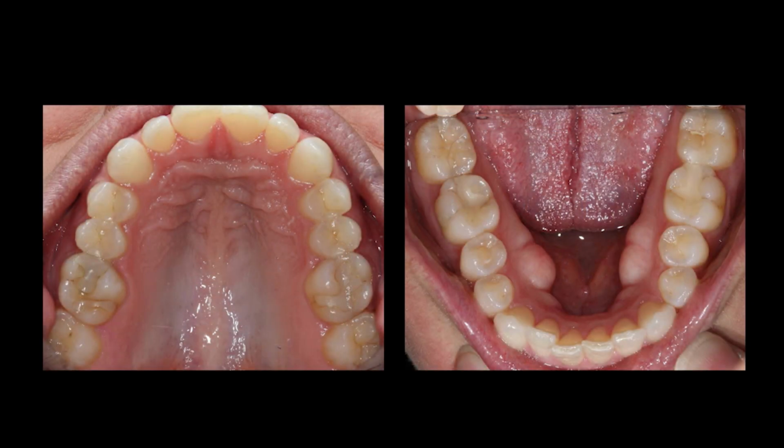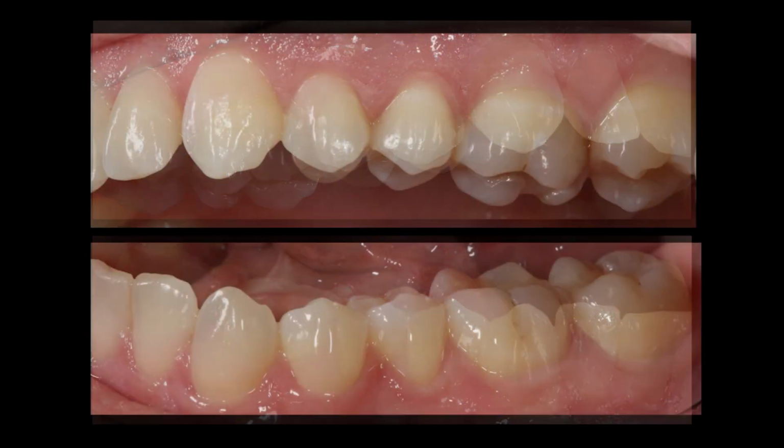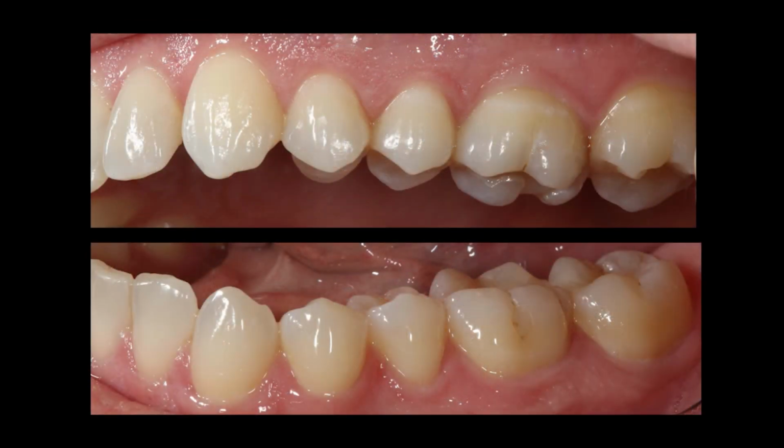Now here'd be another add-on or a purchase that you need to make of some good occlusal mirrors. A little bit tricky on taking these, but you're really taking a picture of the mirror, not necessarily of the arch, using a little bit of air and blowing it on the mirror to keep any of the steam off of it. Buccal corridor pictures for right and left lateral, showing wear for the patient. Great documentation. Also for Invisalign, I believe they require an awful lot of that.